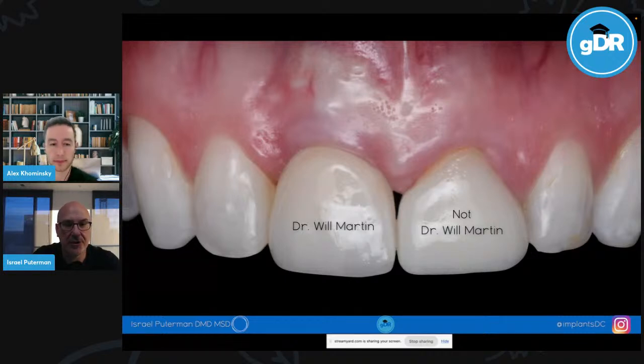Basically, it's a starter drill, and I use Straumann as my implant. Once I use the 2.2 drill, I have to use the next drill non-guided. It's just a matter of spacing issues. 90% of them are fully guided. The only reason I wouldn't is if there just isn't enough interproximal space. Right, understood.